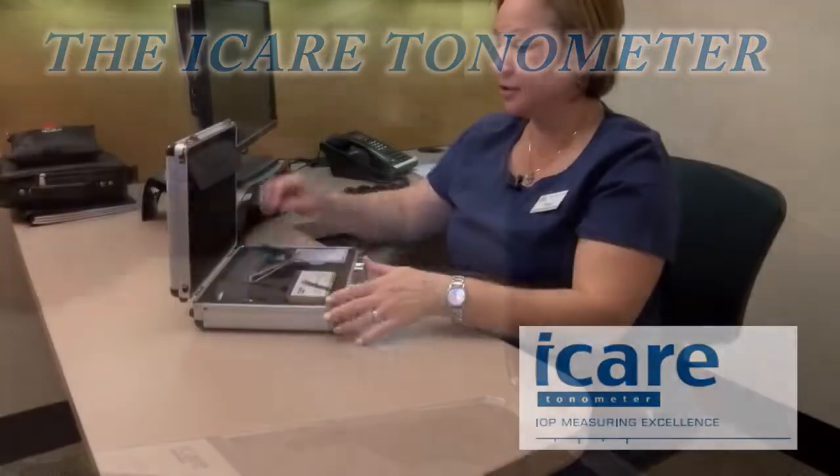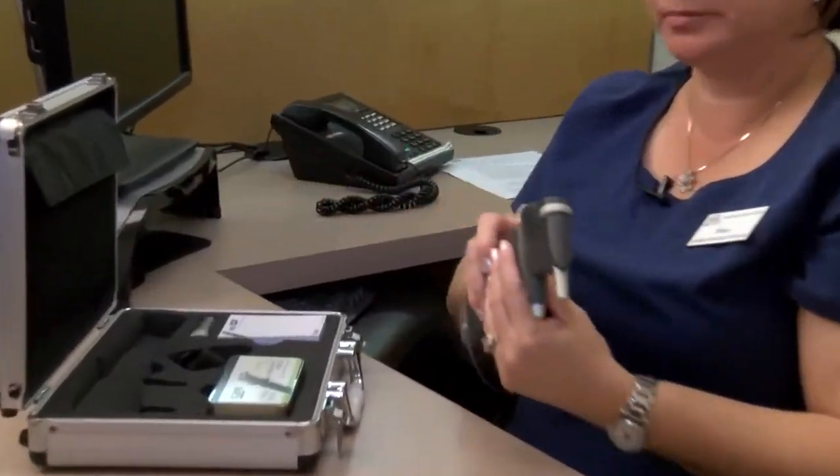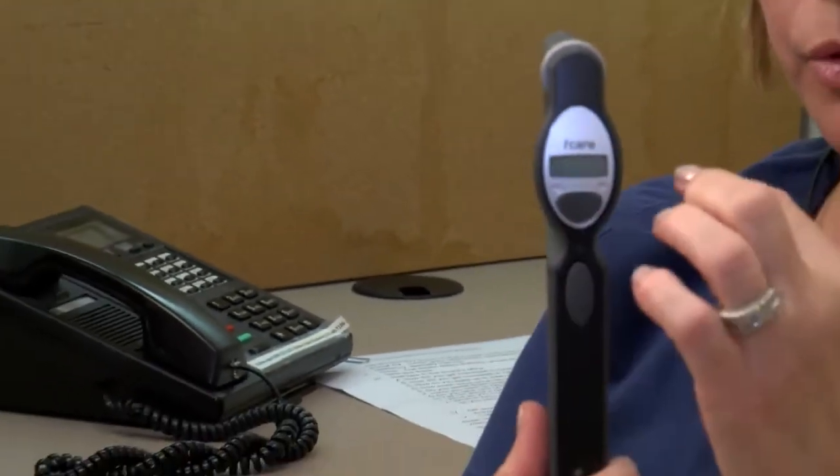We're going to take our iCare tonometer, get ready to use and load. Press the button once — it says 'on.' And then it beeps on its own when it's ready to load. It says 'load.'